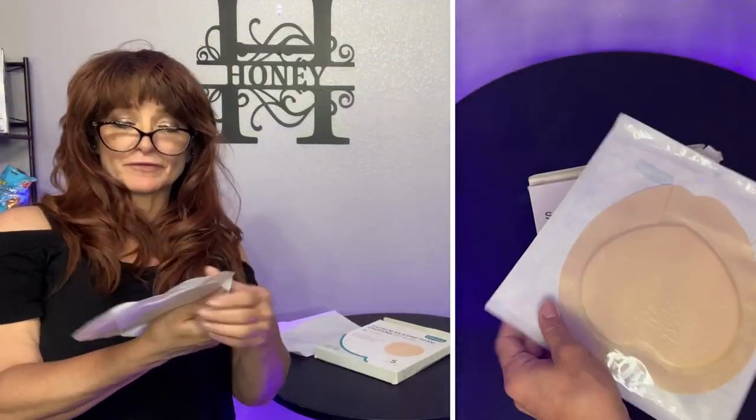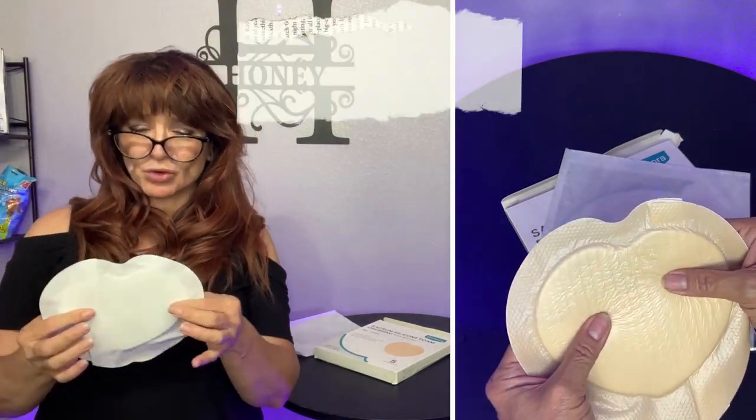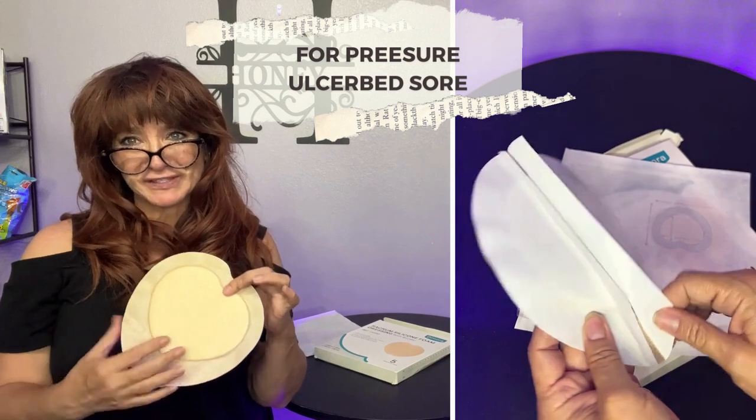This is great for your sacrum — that lower back area — especially for people that might be bedridden or that are stuck and kind of get bed sores happening. I'd like to thank Damora for sending this to me to review.